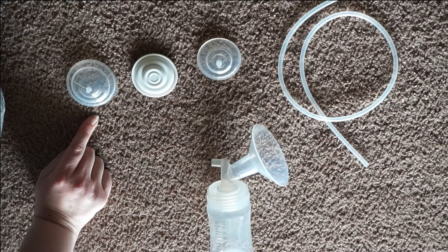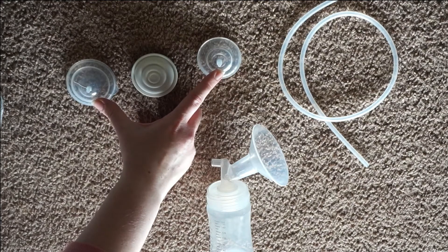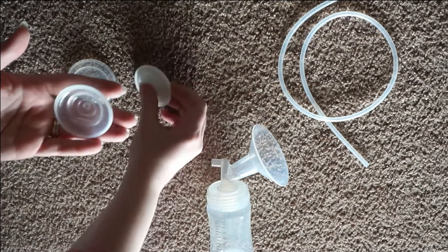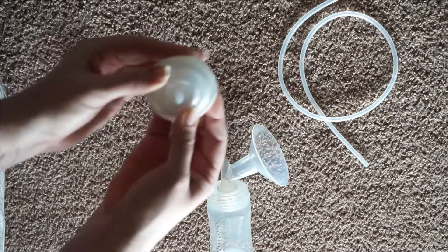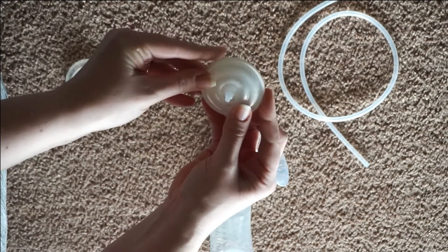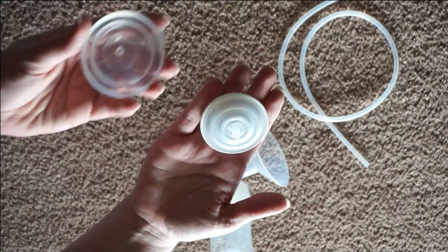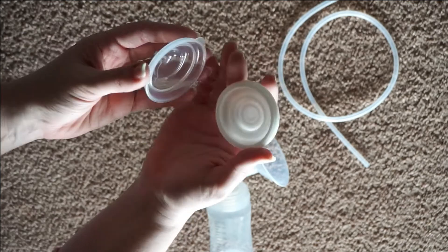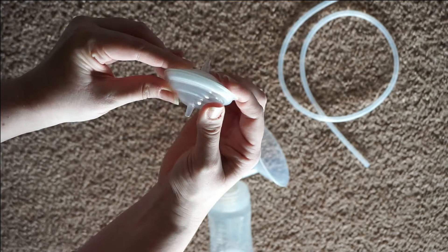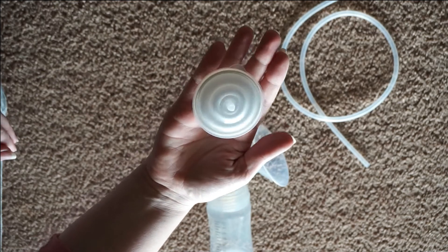Right here you have the three pieces that make up the backflow protector. This white piece is a membrane, and these two are the harder outer shells. You're going to take this smaller plastic disc, hold it, place the membrane over, and then slowly wrap your fingers around the edges and pull it up so it's nice and even. Then take the bigger plastic piece, put it on the back, and sandwich it together until everything feels nice and flush. And then you've got your assembled backflow protector, just like that.